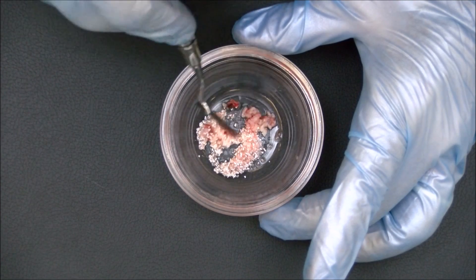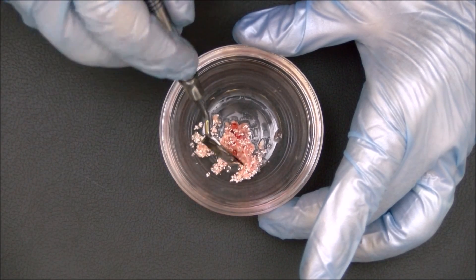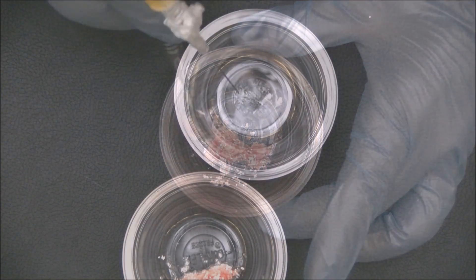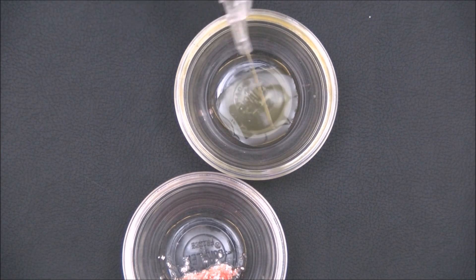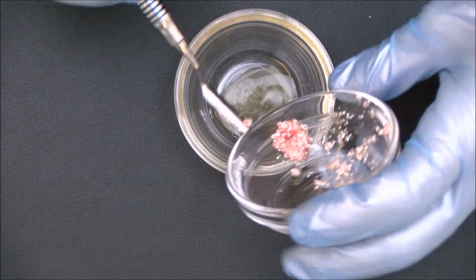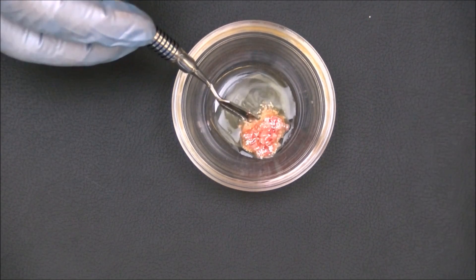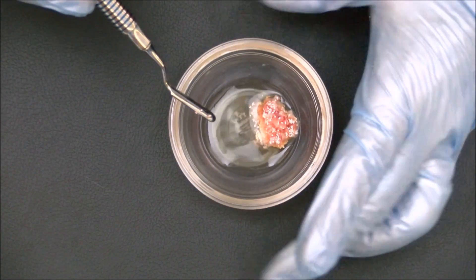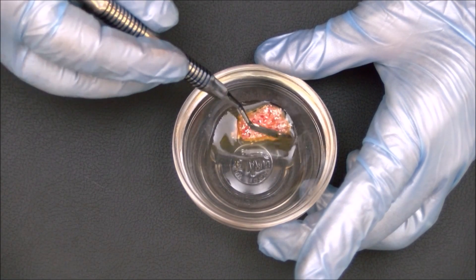We now mix the PRF into the graft material until it is evenly distributed. Into a second sterile dappen dish, we then place one cc of the plasma harvested from the white top tube. The bone graft is then added to the plasma. The graft is then gently manipulated to make sure that it is completely immersed within the plasma.